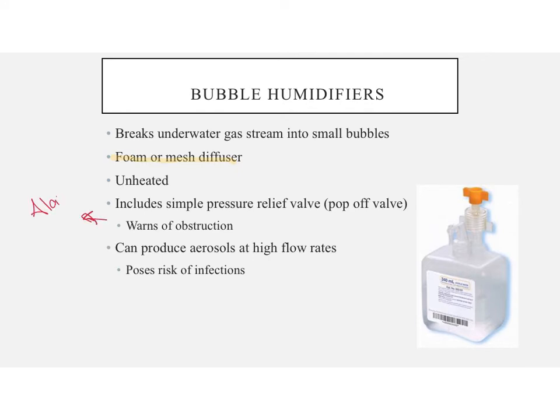alarm at greater than or equal to 2 psi when it is occluded. So think for a minute, how might a nasal cannula become occluded?